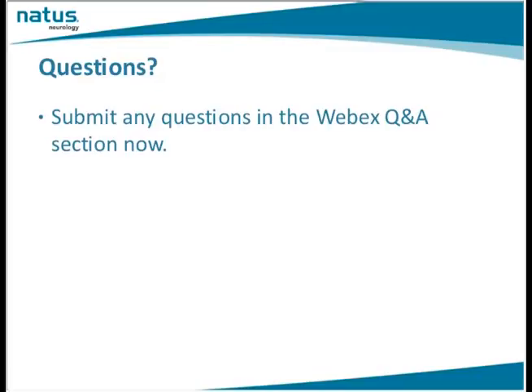Now, sometimes, if I'm in a cath lab situation, I will get an extension cord and plug in outside of the room that has the fluoroscopy and what have you, to clean up some electrical interference, like the ambient noise. If you plug in outside of the unit where you are, sometimes that will make it go away. Don't use the outlets in the cath lab room itself. It's a good suggestion. That's a good trick, and it does work. But as far as Bovie, no, you can't.